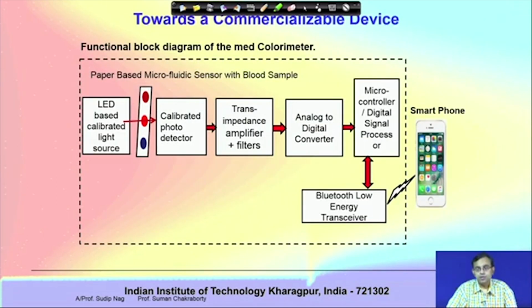Now, what next? So, we have started with a very simple idea of take a drop of blood, load it on a device and do some test that you want. In laboratory, even in field for one or two isolated cases, it may sound to be trivial, but how to make a commercial device out of it which can be used in the context of rural healthcare. So, the next agenda of my talk is towards a commercializable device.